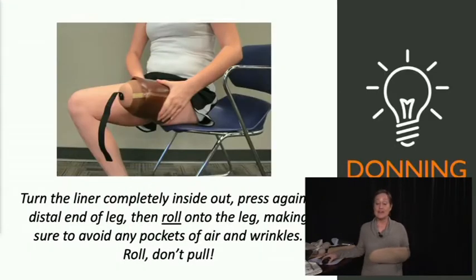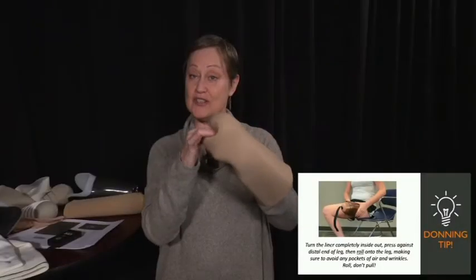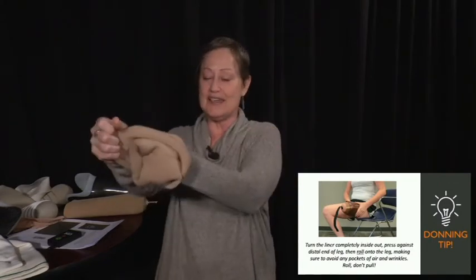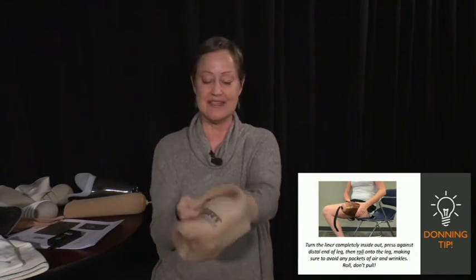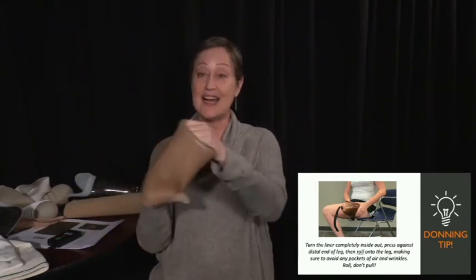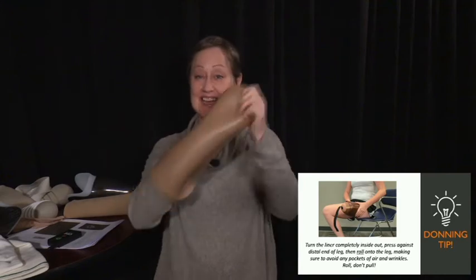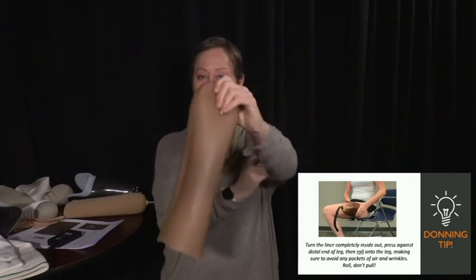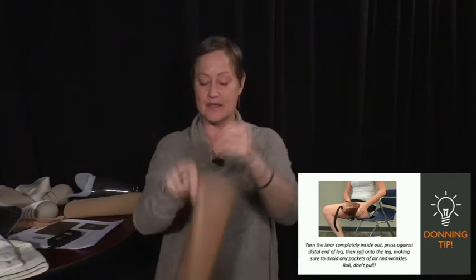So for donning, you have the patient turn the liner completely inside out, which we have people doing with all kinds of manual dexterity issues, and it's not as easy as it can look, right? So yeah, I just had to fight with that one. Turn it completely inside out.